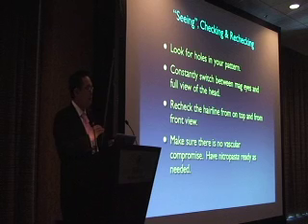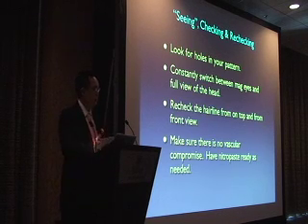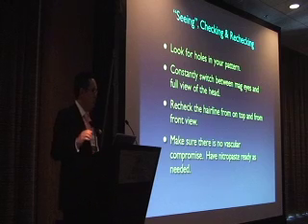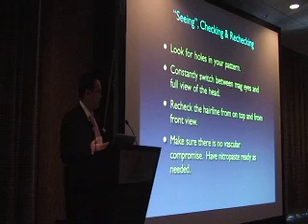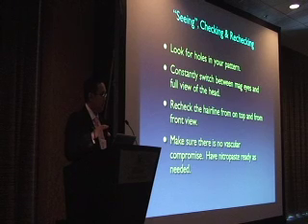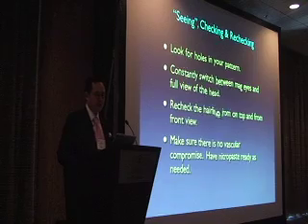You're making sure that your hairline stays straight, and you're constantly going between mag eyes and a full view of the head. And always recheck your hairlines from all different angles when you're done. Just recheck and check and recheck. And a good thing is that even with all the techniques I've told you, you can still have a little darkening effect on the skin from vascular compromise. So you should always have nitro paste in your office, in my opinion.